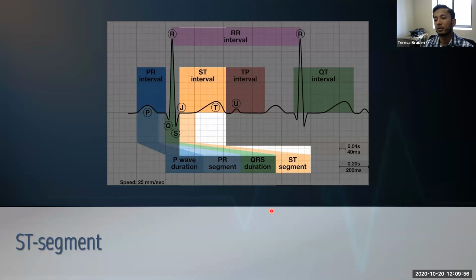So then it's going to be measuring from the wrong thing. If it measures the QRS as being the previous T wave because it was so high, and then it measures to the next T wave because the QRSs are dulled from the low voltage, then you'll see a strip or a QTc that's crazy long.